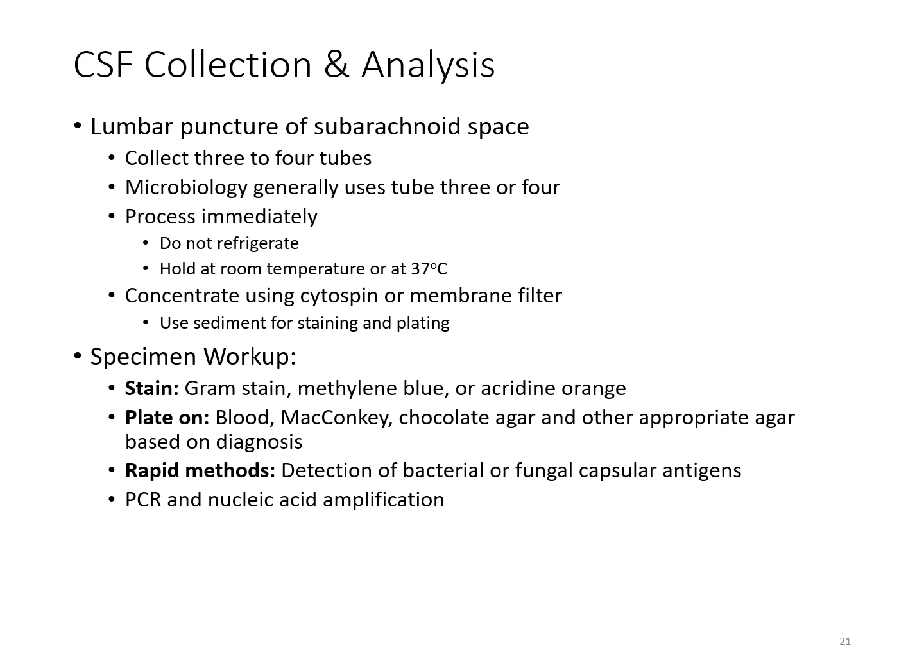You will need to concentrate it, so you'll do this through some sort of mechanism like doing a cytospin or using some sort of membrane filter to make that sediment and then ultimately stain and plate that sediment. Hopefully all of your organisms have been reduced down into that sediment and you will be able to catch them. Now your workup is going to include a gram stain or some sort of stain depending on what you're looking for, and of course plating it on your media, your blood agar, MacConkey, chocolate, or anything else that's going to be appropriate for that particular diagnosis, and potentially based off that gram stain.